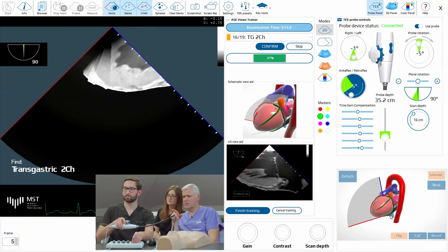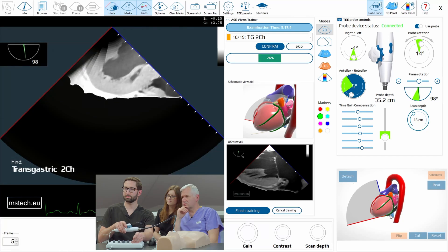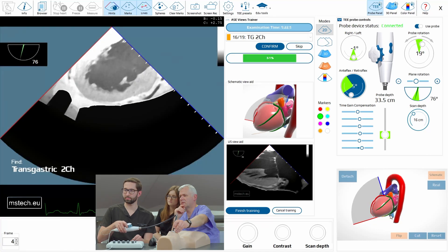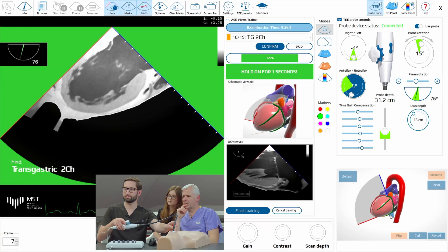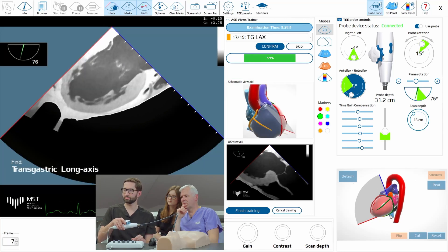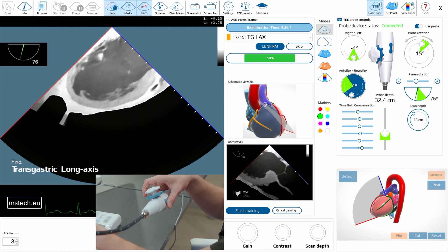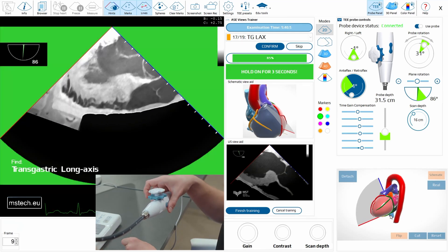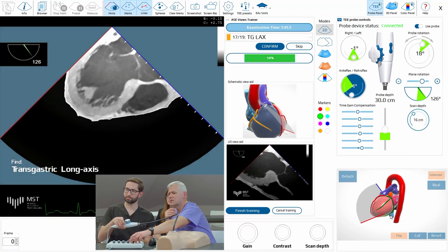Normally it beeps but the speaker is off, that's why it does not show you when you should go on. Slightly higher. Good. And the long axis with the aorta — don't change anything, just rotate clockwise. Now increase the angle when you have the aorta in view. It should be slightly increased.